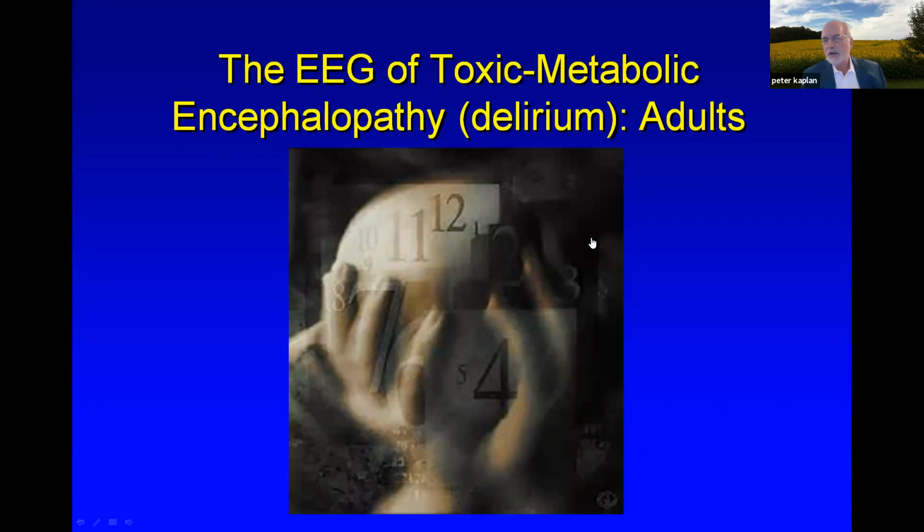And typically, structural abnormalities that are focal with preserved brainstem do not produce relevant explanations of why the patient has mild alteration. The study of choice is not the head CT or the MRI, it's actually the EEG, for the reasons that it will triage between factitious, sleep, non-convulsive status, and encephalopathy.